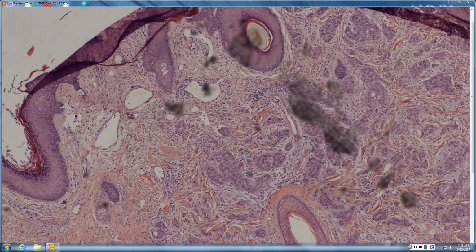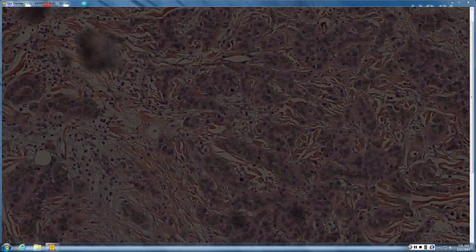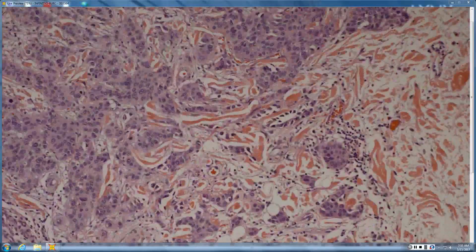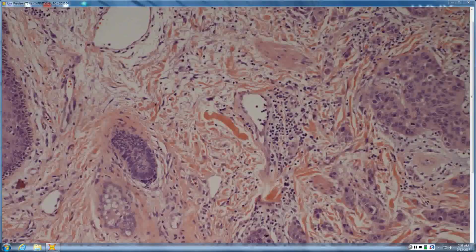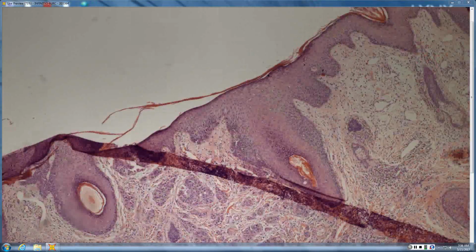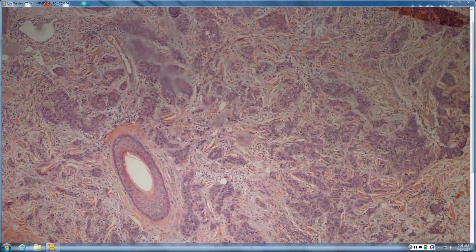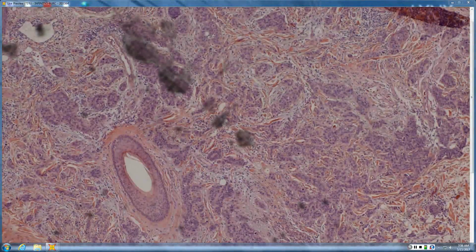We've got some dermal deposition of some blue cells. A fairly good amount of cytoplasm in there. Bigger nuclei. Kind of nested appearance. Honestly, I would have looked at this, and my first thought would have been there's no epidermal connection. Well, there actually maybe is focally. So either primary squamous cell carcinoma or epidermotropic metastasis of squamous cell carcinoma would probably have been top on my list.